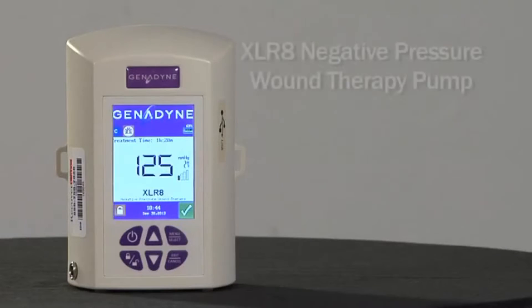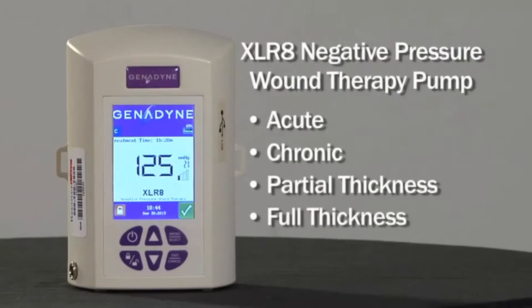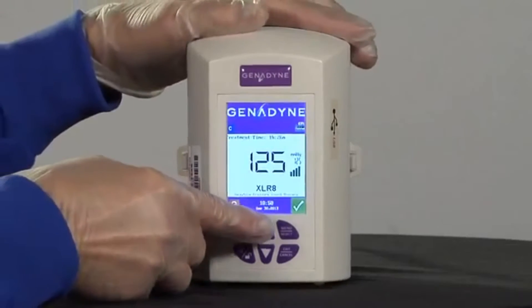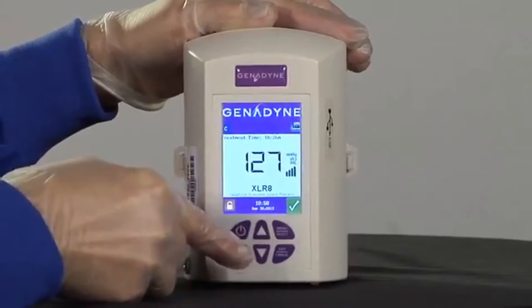Welcome to the educational program on the Accelerate Negative Pressure Wound Therapy Pump. The Accelerate Pump is indicated for use on patients with acute, chronic, partial thickness, or full thickness wounds. The Accelerate provides advanced technology using the industry standard negative 125 millimeters of mercury, but may be adjusted in increments of 1 millimeter to meet a specific prescribing physician's order.